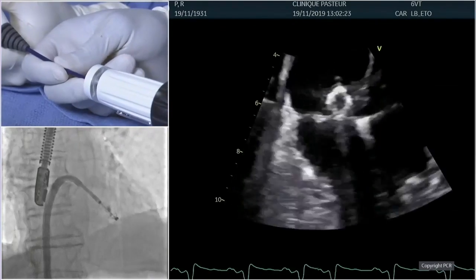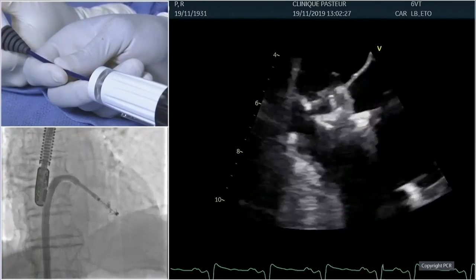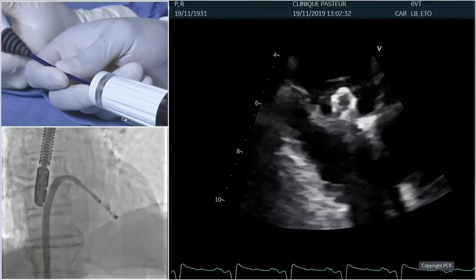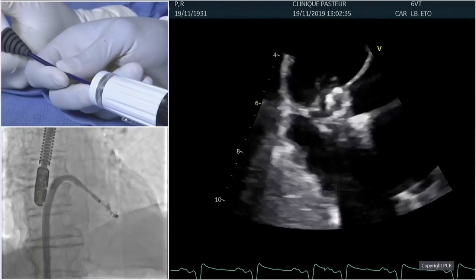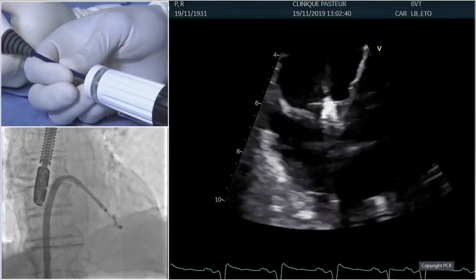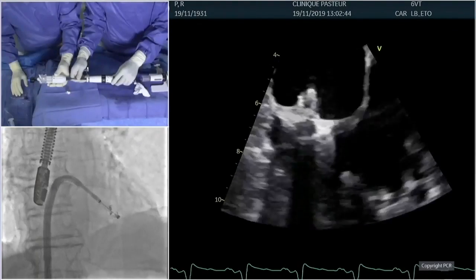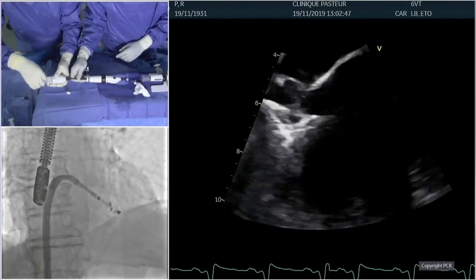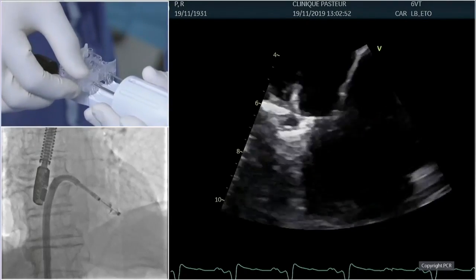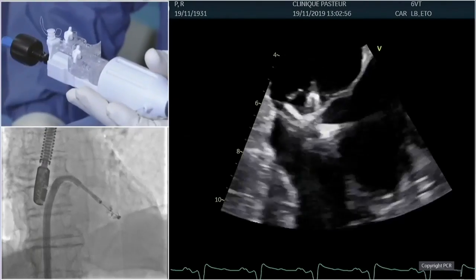So, Cheche, what's your experience regarding the independent leaflet grasping? So you go first with the PML? First with the posterior, as most of the challenge was capturing the posterior. We may capture first the posterior and then go to the anterior. Okay, this would be your advice. We're going to do that. Okay, Nico, so let's capture first the posterior. Posterior is in. Okay, so I remove the slider pin. Let's take advantage of the feature of the device. Okay, and I'm descending the posterior clasp. Okay, so we see the bouncing now.